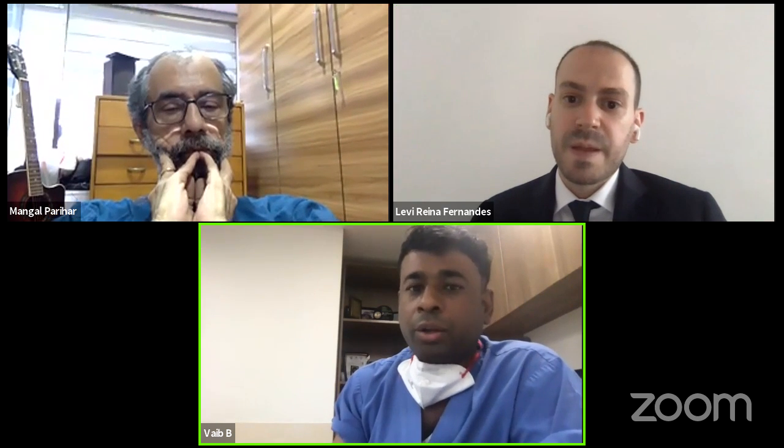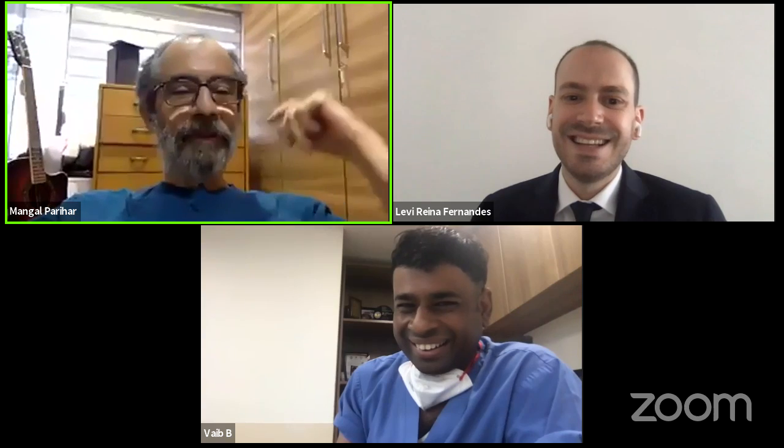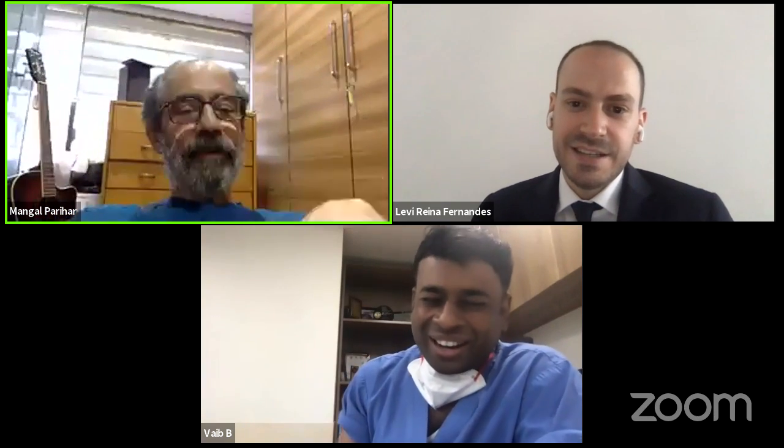Exactly, that's the point. So would the software tell us that, look, these are the guys who should be referred to me versus who should be sent to Mangal? No, you can send all to me, because I do joints also, not a problem. No, actually, same here. But I do.